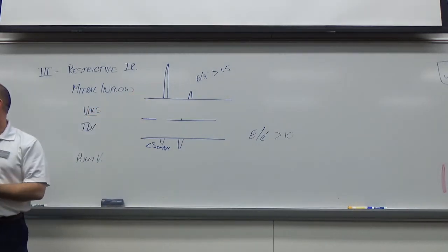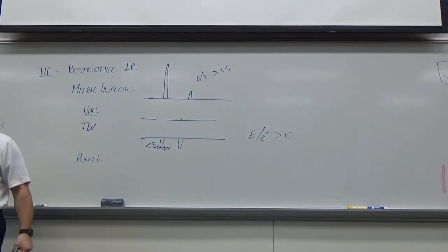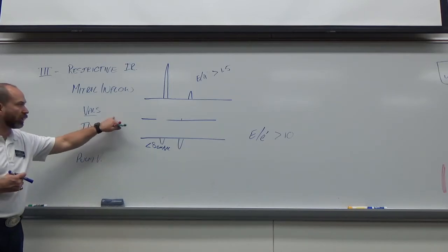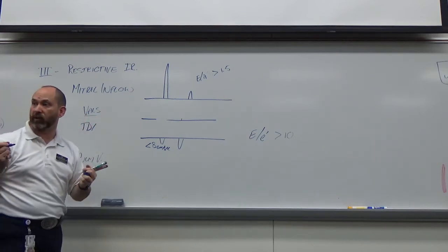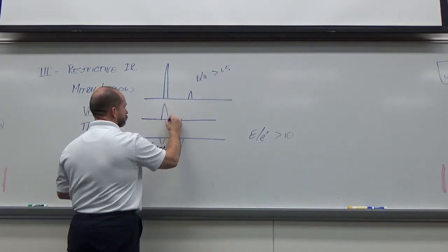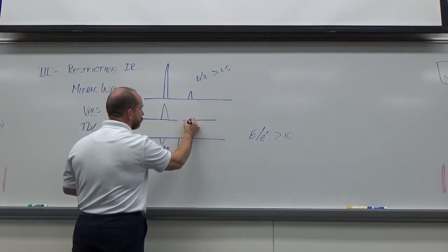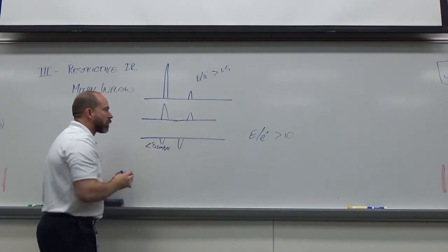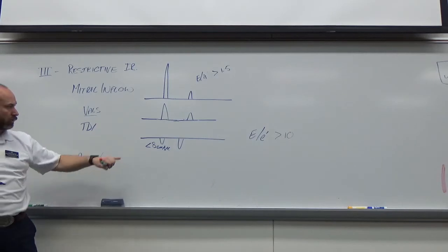Do we have any other distinctions on the irreversible? So E is much greater, by more than 1.5 times. Often you'll be up around 2. Valsalva, okay, but it doesn't reverse, right? So it might dampen it. My A wave is getting closer to my E wave again. Okay, so this relationship didn't change as far as the ratio of the E and A goes.